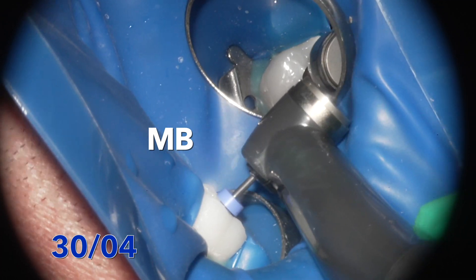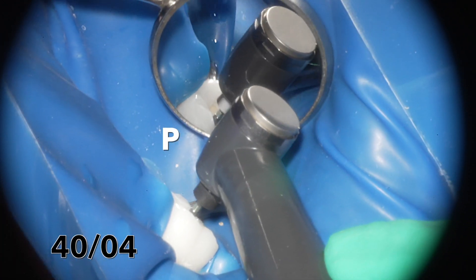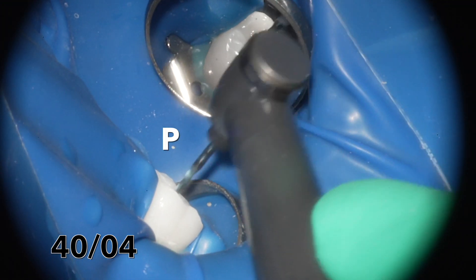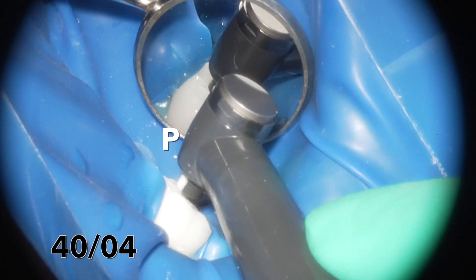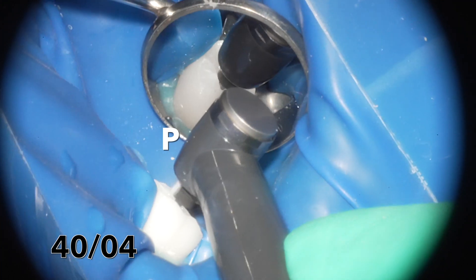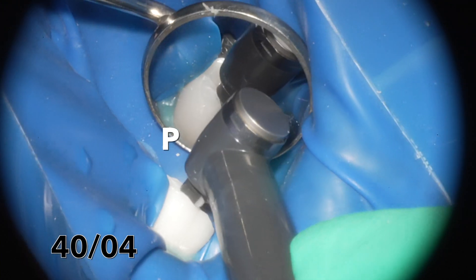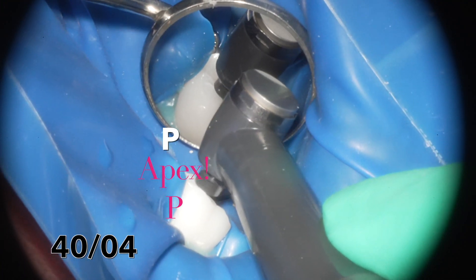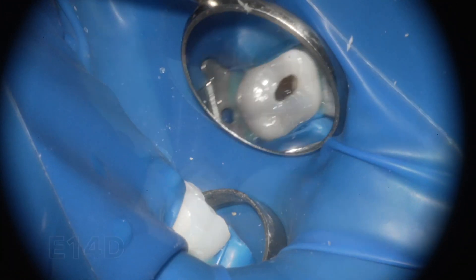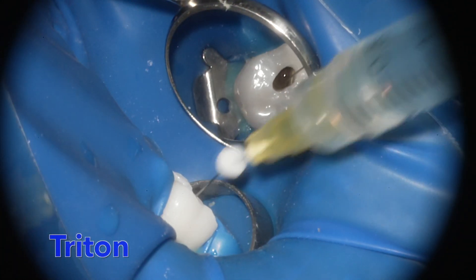The 20 created a nice path and I'm taking the 30 down to the end on the mesiobuccal. So I have 30 in the mesiobuccal, 20 on the distobuccal, though 30 was close as well. On the palatal I decided to go a little larger than size 30. You can see the size 40 is getting quite engaged but does reach the apex on the palatal canal, giving nice engagement with a constant taper.